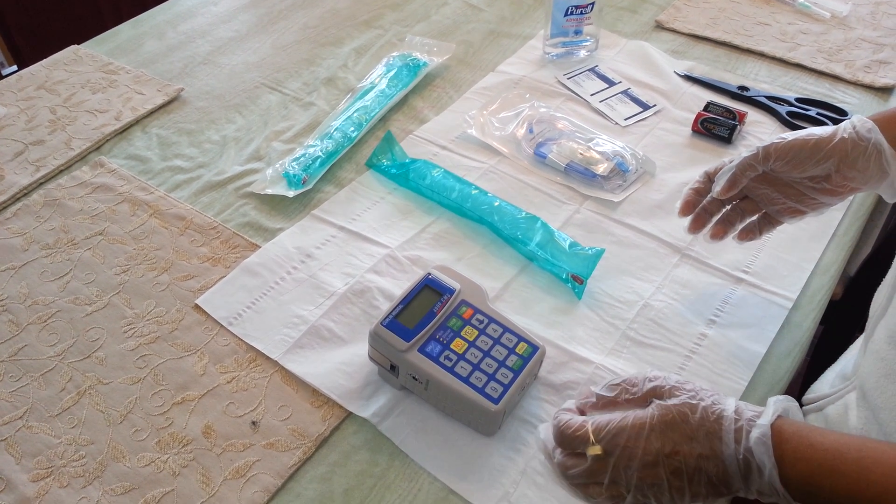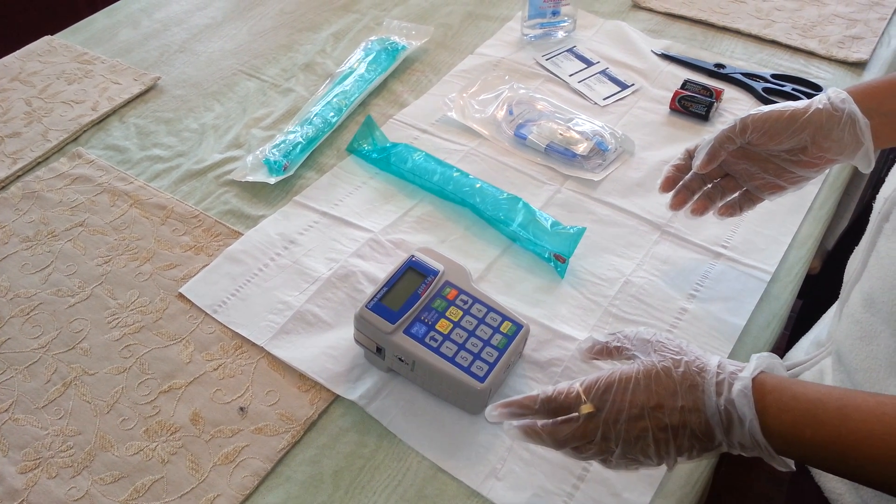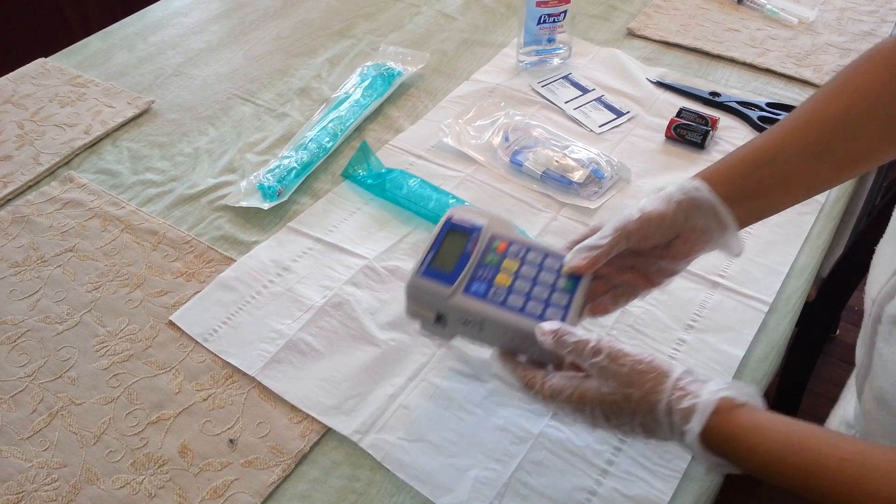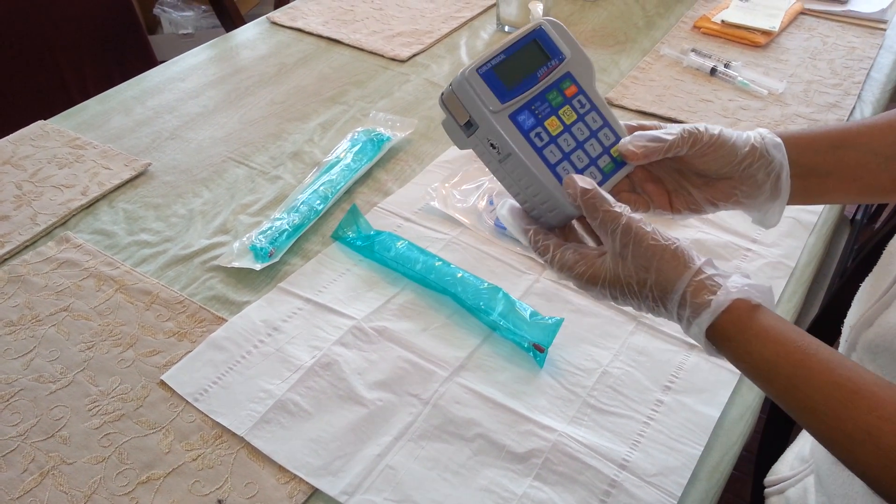Hello friends, this video is being presented by dpncare.com. Today I am going to show you how we connect tubing to a Curlin pump.